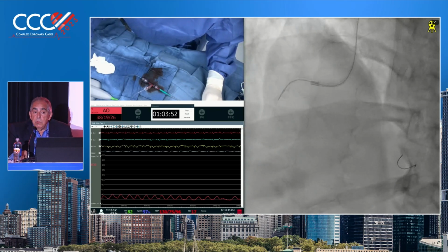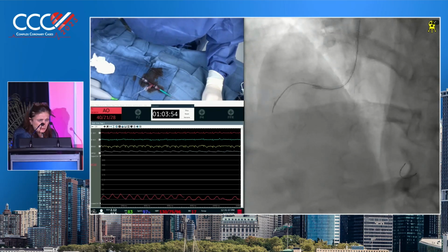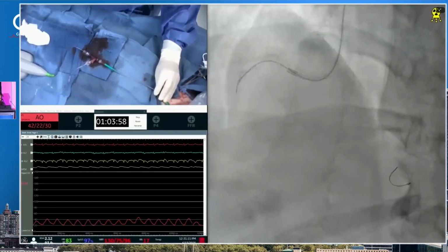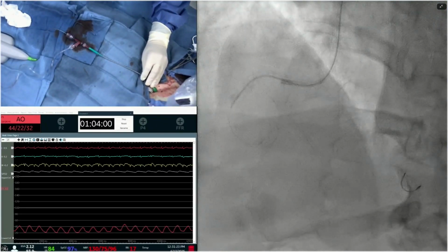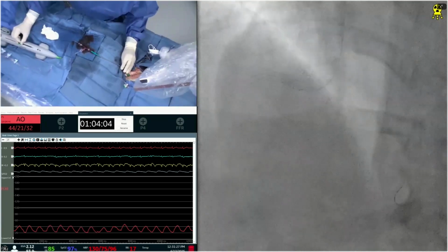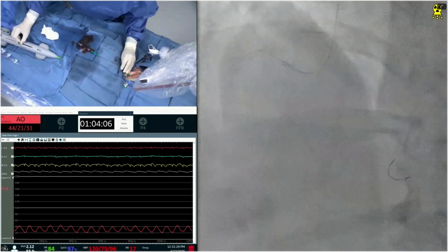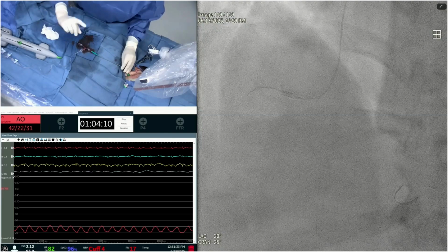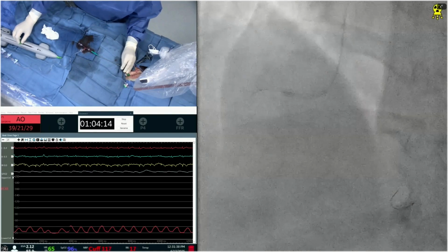And we see what's problematic here. Dr. Sharma, you want to talk through how you use orbital atherectomy? Yeah, remember orbital is 1 millimeter per second, and compared to Rota where there is a pecking motion, here you can go forward and back and forth, but make sure, because the machine will stop at 25 seconds. So back and forth, you need to go forward and come back at 1 millimeter per second.